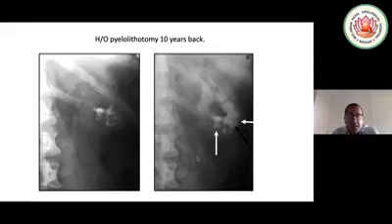Listen, now I will surprise you a little bit. A previously operated patient is, I would say, an advantage in supine, because the scar usually stabilizes the kidney and you have less hypermobility when compared to normal patients. So the fact that the patient has already undergone a previous open surgery is not a big deal. This is for sure a good case for supine, and I would say for ECIRS, because you know this stone is very, very branched, so it's impossible to clear only percutaneously. And I think that a good cooperation between two surgeons, one ureteroscopically, one nephroscopically, can do a good job. That being said, it is definitely a very, very difficult case because you have multiple stones everywhere. But of course, maybe it will require 2 stages, but I would go for ECIRS in supine position.